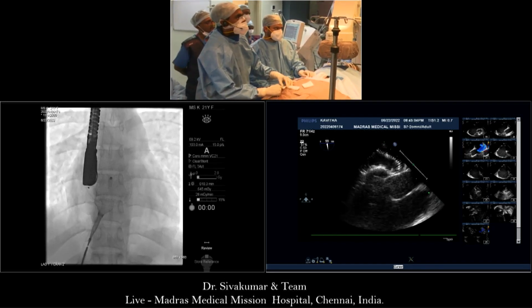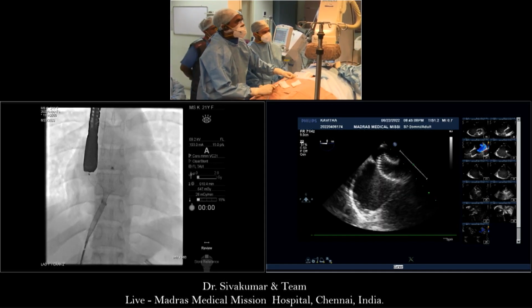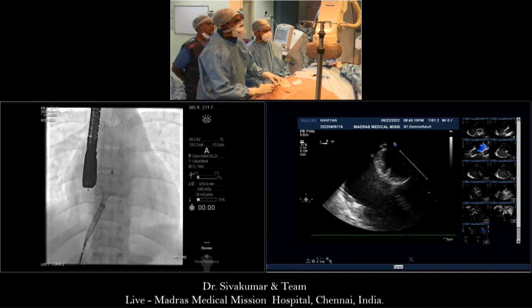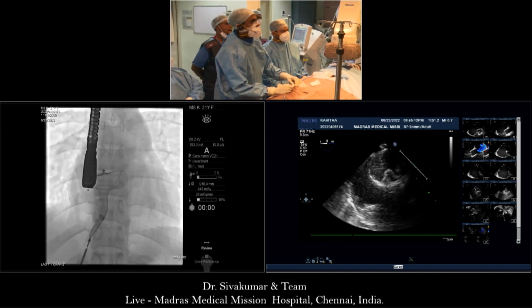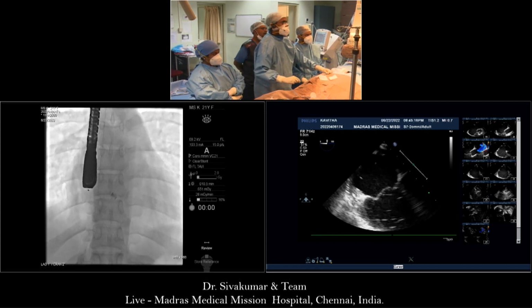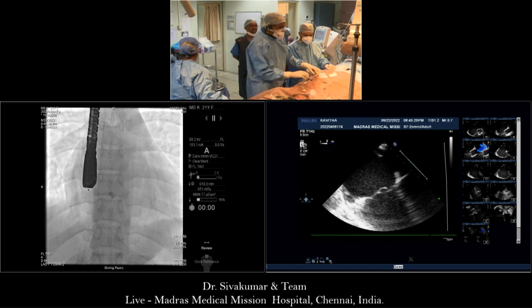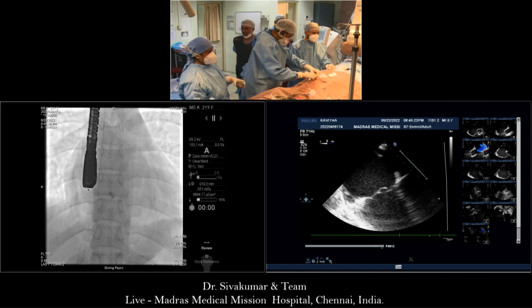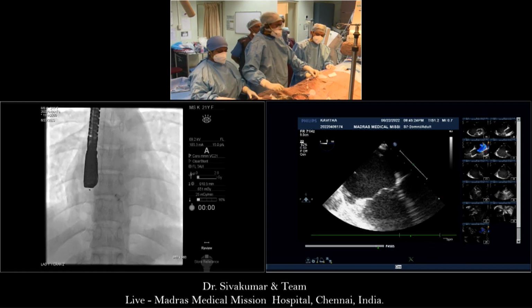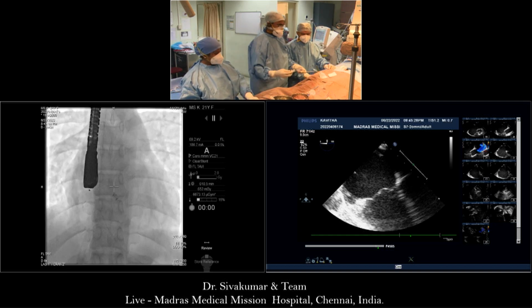Zero degree. There you go. Okay, get me back that 40 device. Shiva, you do what you want to do and don't listen to anything else. Just give another 2 minutes and I will be getting that 40 inside. I am de-airing the sheath.